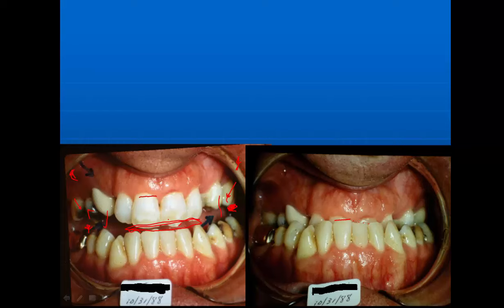I want to pick these up to where they're kind of lined up with the upper teeth. The bottom, I don't think we used the intruding arch at all. It's lined up pretty good like that to start with. So we didn't have to use one on it.